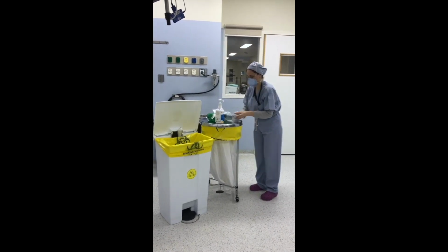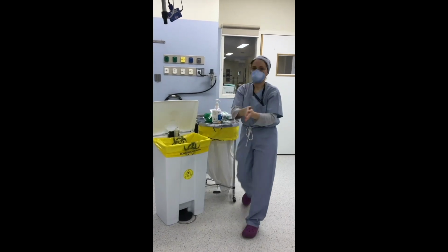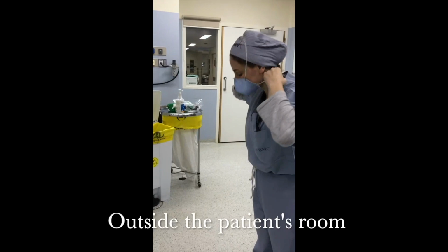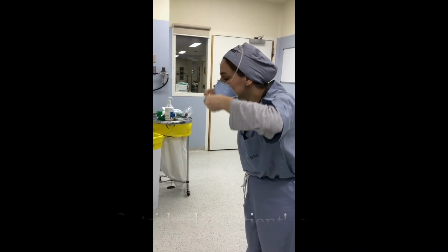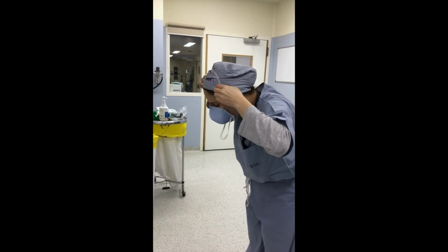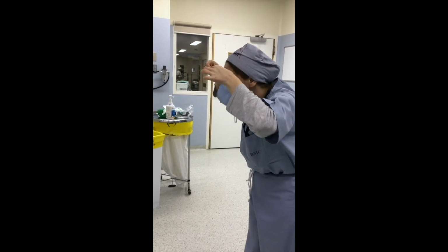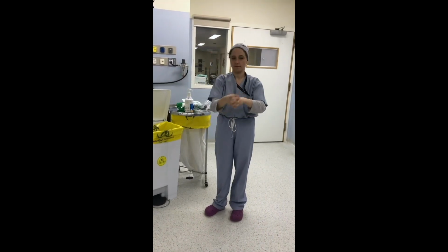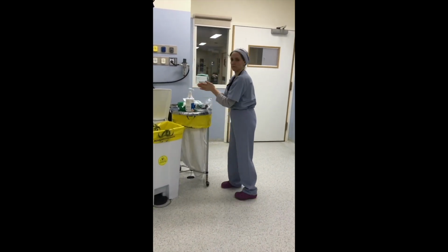You will have to keep your N95 until you come out of the room. To remove your N95, take out the strap, don't touch your face, and dispose it. Wash your hands with soap and water at the end of the procedure.